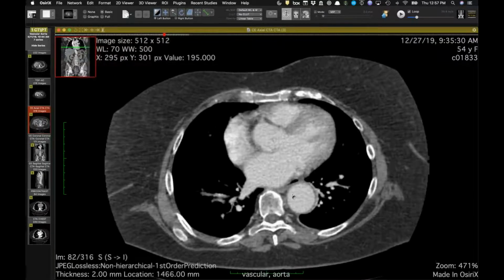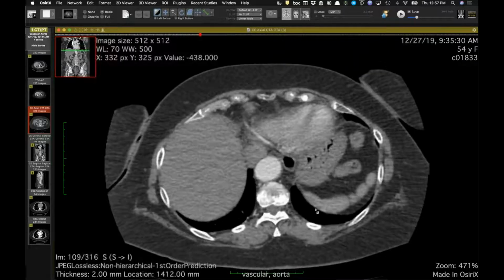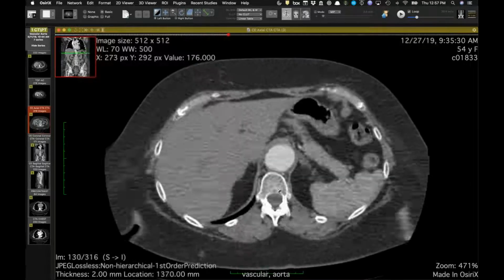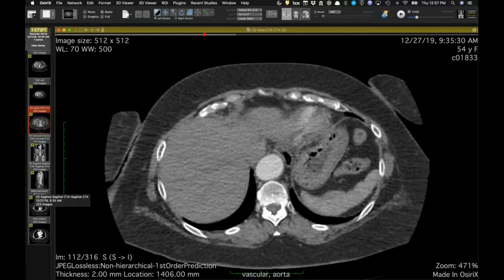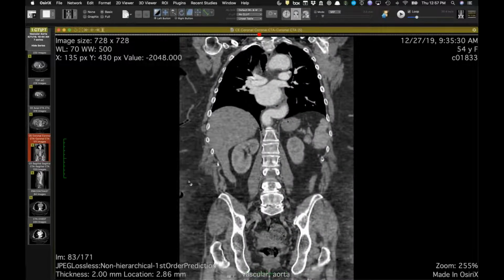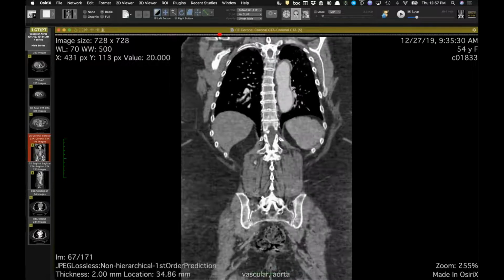especially down lower, you have some dilation of the descending aorta, maybe a little bit of wall thickening, and then you've got weird little segmental areas that are a little bit narrower. So it's kind of got this beaded appearance. And we did have one prior CT to compare to, and I think you can see on the coronal that there's a little bit of wall thickening here too.